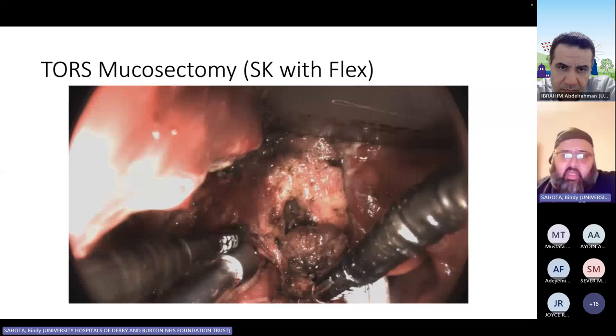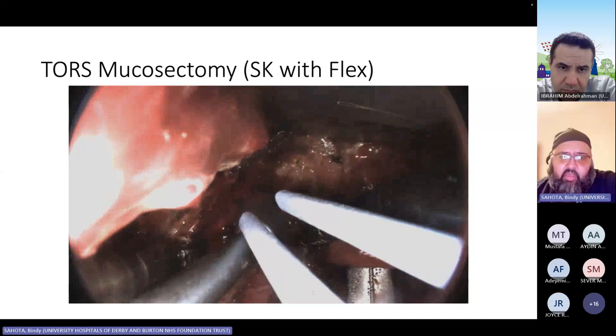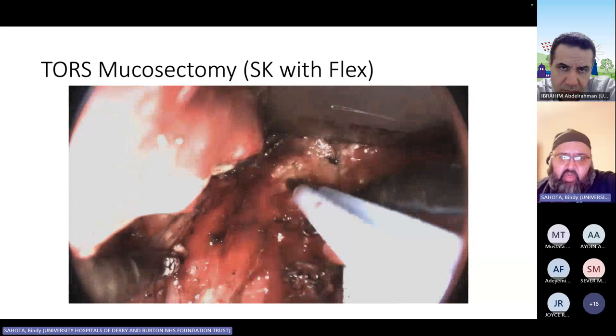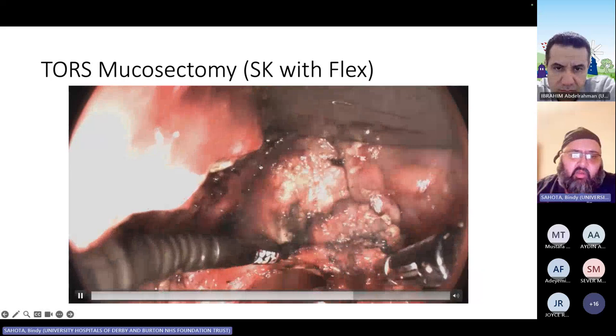Like I say, there's always a couple of branches down here that you just got to be wary of, and you can use a combination of clips and bipolar here to just get control over it. So the dorsal lingual artery is not going to be a million miles away from it, and there's often some decent sized branches. Here's the left side coming off. So you can see that as one piece.